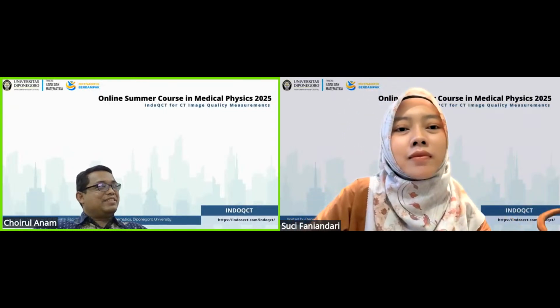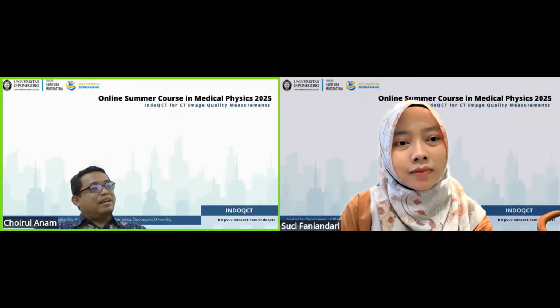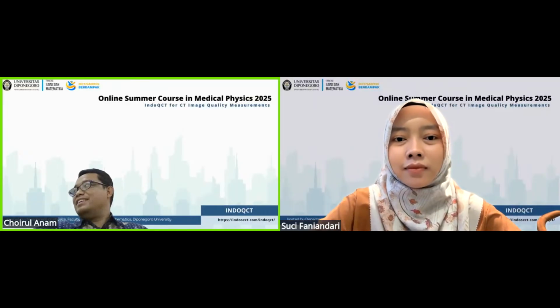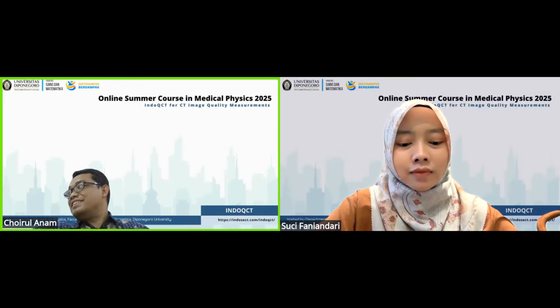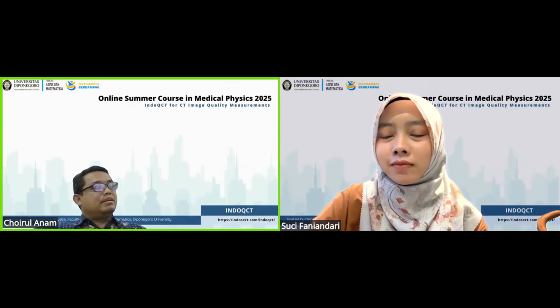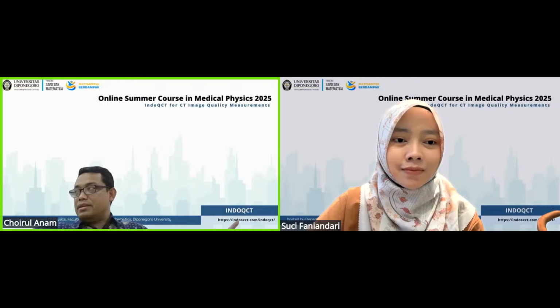For the second question, it depends on the regulatory body. In Indonesia, if we use, for example, the NPS as the metric for the image quality, we should educate the medical physicists in the hospital. It depends on the patent or the regulation. I think in Indonesia maybe we need a longer time. But in America now, not only the noise level but also the NPS should be measured from the clinical image from the hospital.